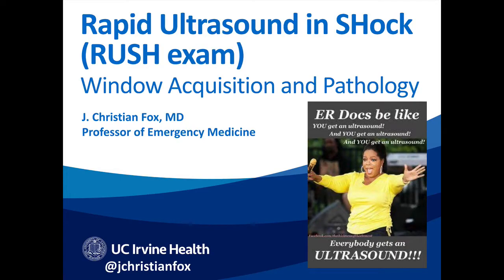All right, we're going to be talking about the RUSH exam, the Rapid Ultrasound in Shock, both practical talk about how to acquire the windows as well as what some of the major pathology looks like. And we're going to be going through a lot of scans here, and it's going to seem a little bit confusing. It reminds me of this picture here with Oprah Winfrey saying, "You get an ultrasound, you get an ultrasound, you get an ultrasound.